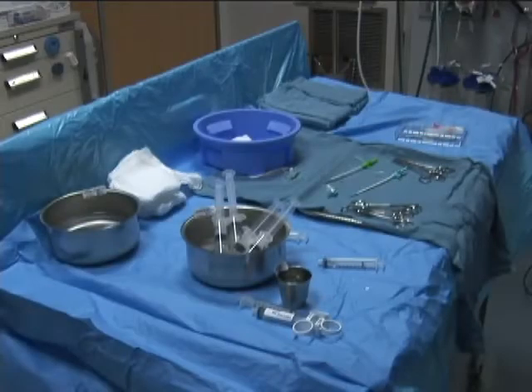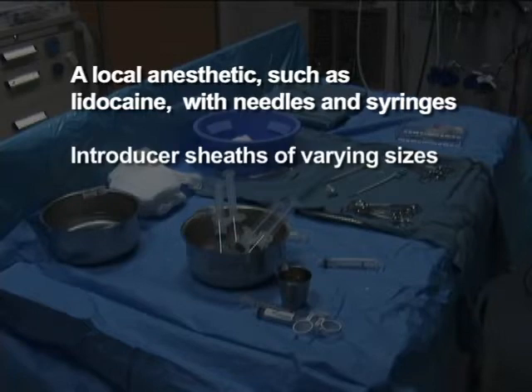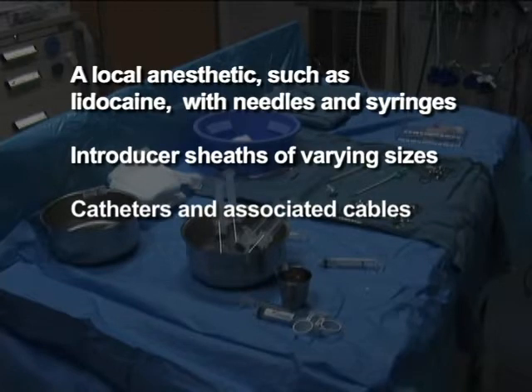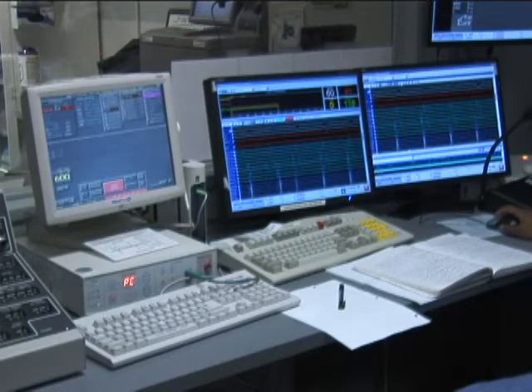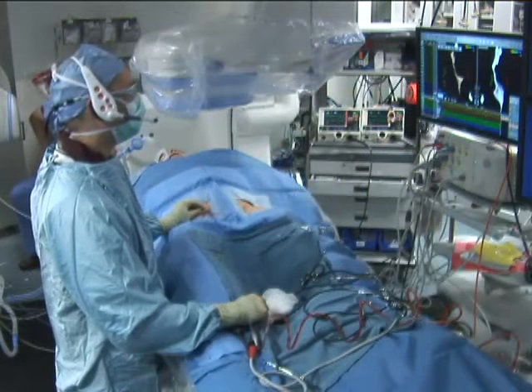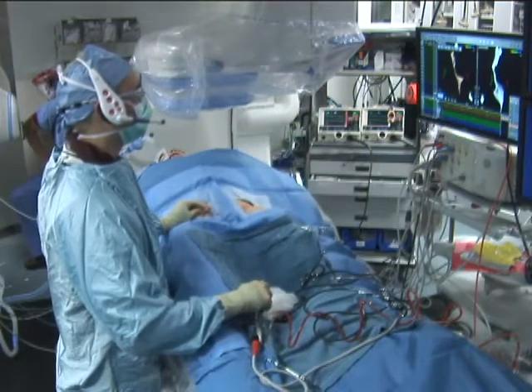The equipment needed for the procedure should be immediately available, including a local anesthetic, such as lidocaine, with needles and syringes, introducer sheaths of varying sizes, catheters, and associated cables. In addition, a recording system, pacing stimulator, and fluoroscopy are needed. Three-dimensional mapping system is optional, but may be helpful to reduce radiation exposure.